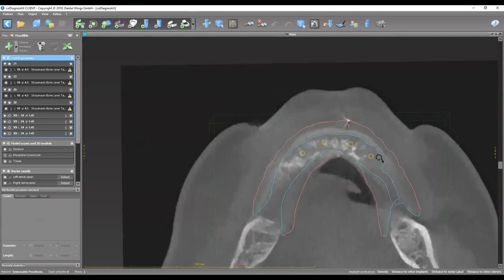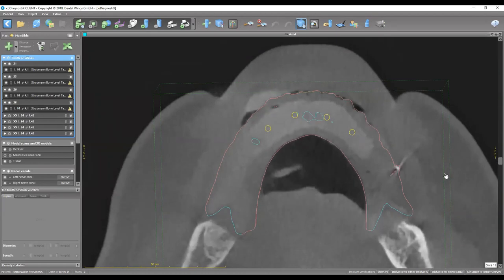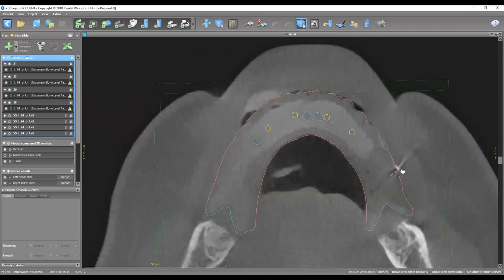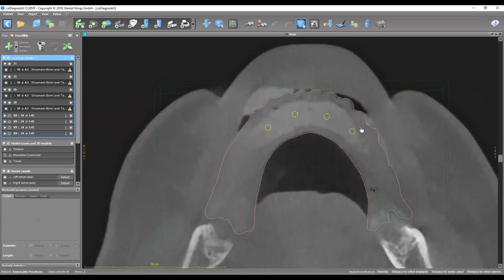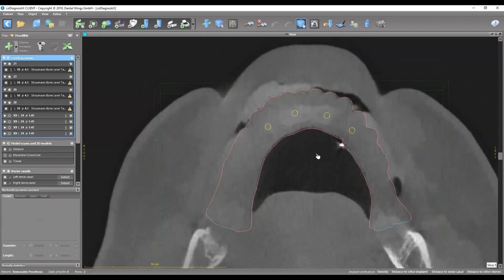If we zoom in and move up and down through the slices, you can notice radiographic markers in the patient's scan. You can also see the outline of that radiographic marker on the denture, which is outlined in pink — that's the one on the buccal surface. We can also see the shadow of the patient's dentition on the denture, and we want to make sure the line is perfectly matching with the outline of the anatomy on the lingual surface as well.